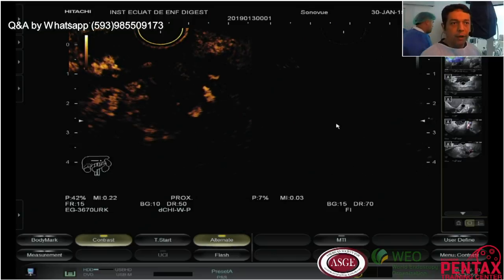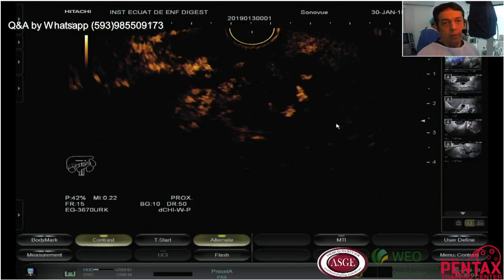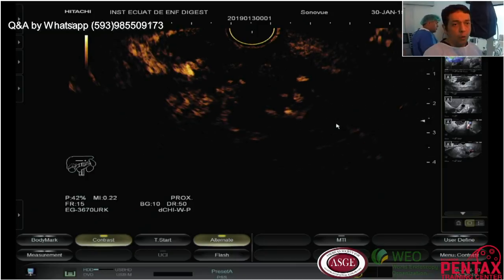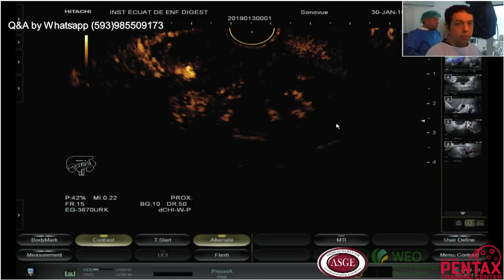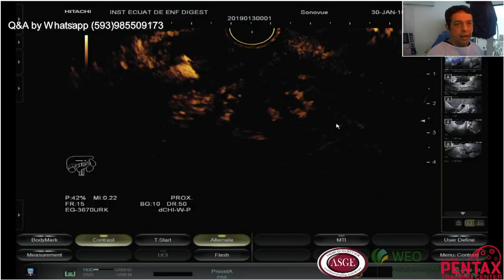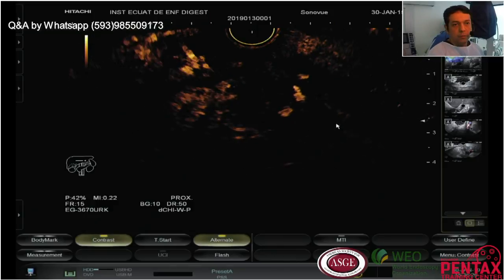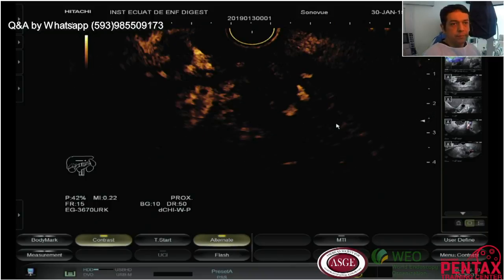First, we can use neurolysis, and second, with all of these things that we saw in this lesion, we will perform an ERCP placing directly a metallic stent, and in this case I will use a fully covered stent to improve the jaundice of this patient.